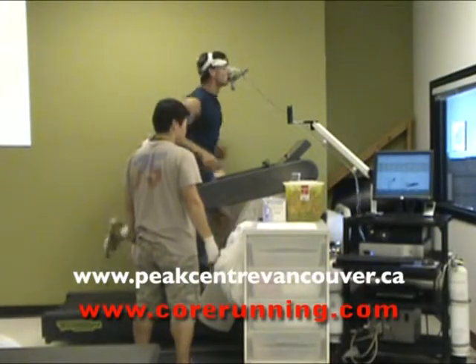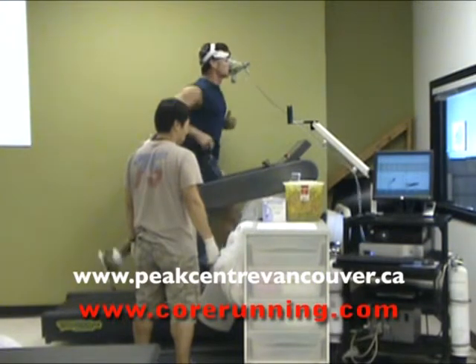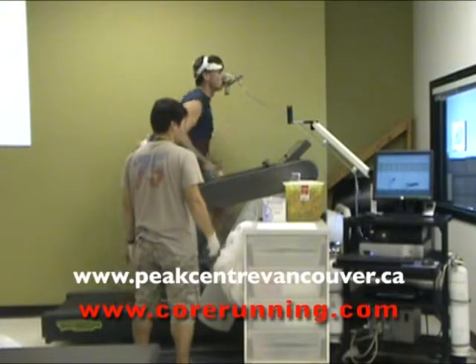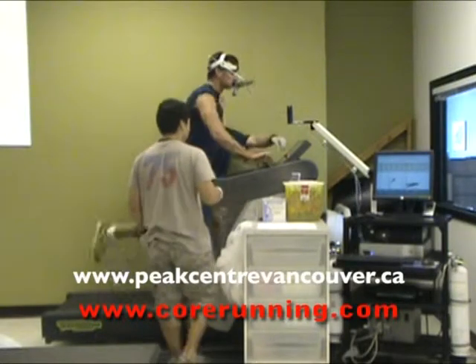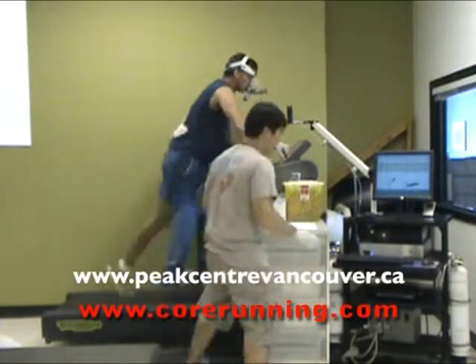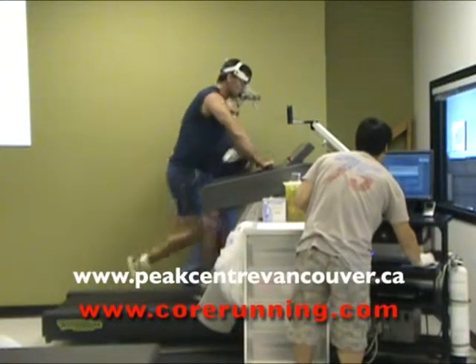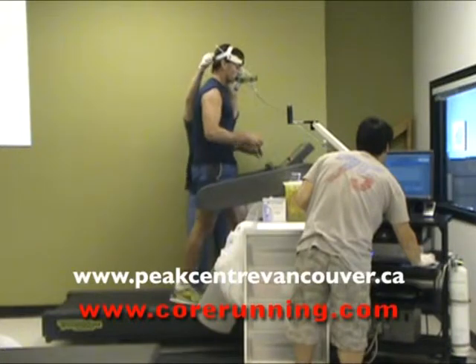10 seconds left. Once you can, once you can. 5, 4, 3, 2, 1 — grab the front. And that's you. And you're off.